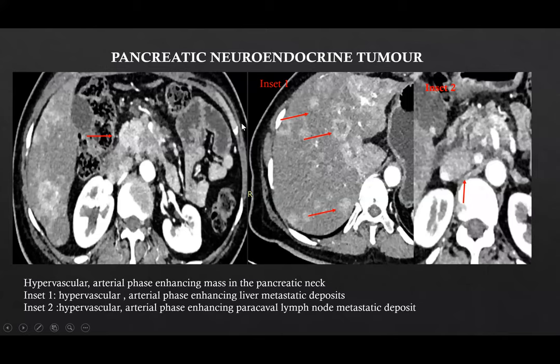This was a case of pancreatic neuroendocrine tumor where we can see a hypervascular enhancing mass in the arterial phase in the pancreatic neck. This was also associated with multiple hypervascular enhancing lesions in the liver as well as a paracaval lymph node metastatic deposit.